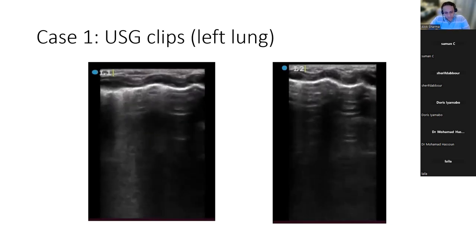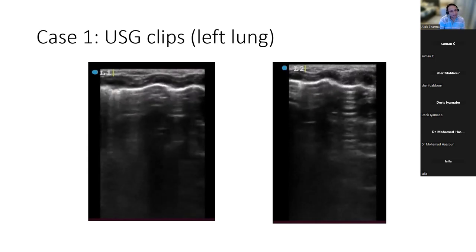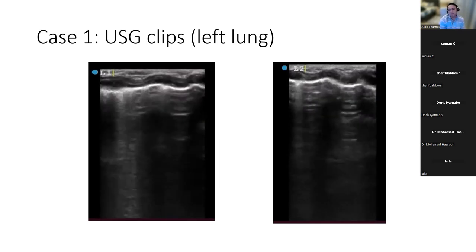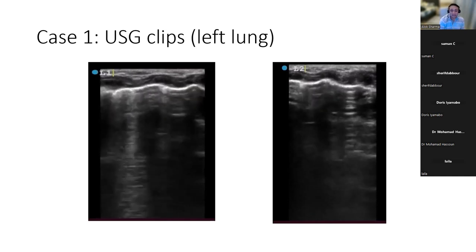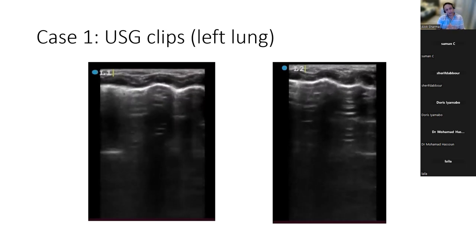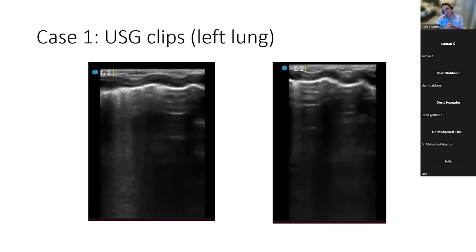Nice images, but you can make them a little bit sharper. Which machine are you using? Sonosite. I'm 100% sure Sonosite has a sharp mode. So have a look, get your tech in. You must get your tech in, because your images are beautiful but just a little bit blurred, and you can definitely get them crisper and sharper just by playing a little bit with what's called dynamics and reflectivity. So get your tech in if you can. And can you save these images, please? Because for me, the essence of peer review going forward is seeing how much we can optimize the image. You can make a good interpretation from this, but let's see.